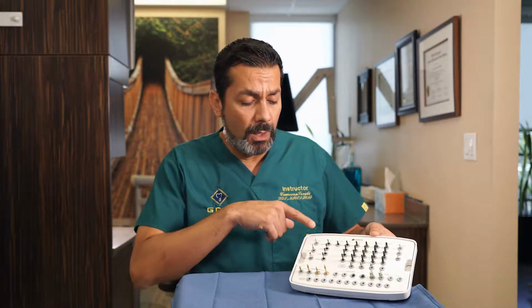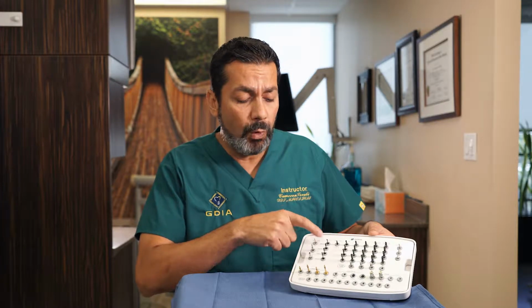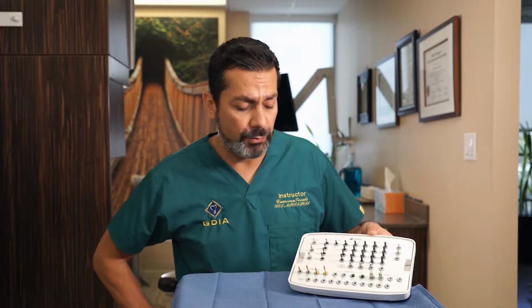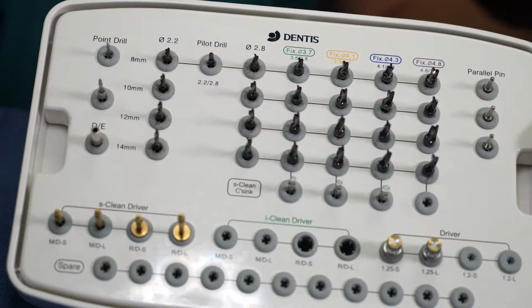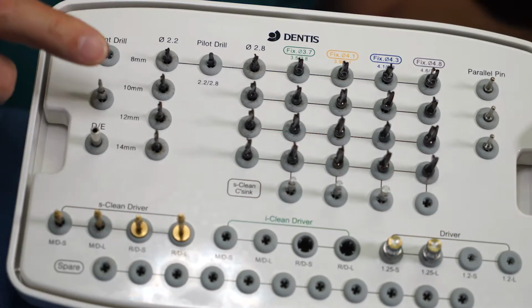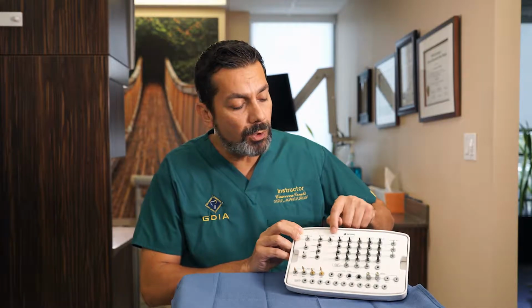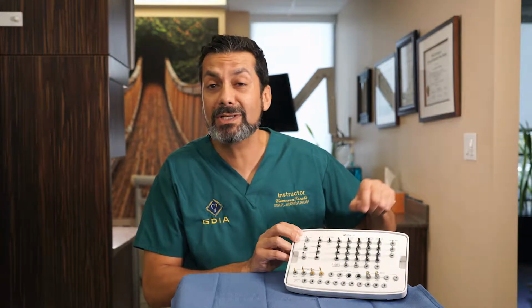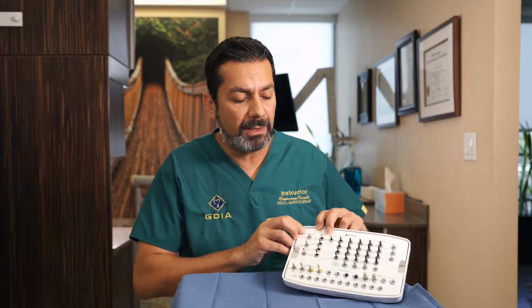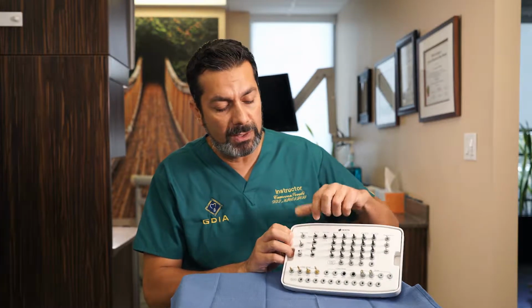drills. So the Dentis implant system comes with 4 lengths as far as your twist drills. So you start with a 2.2 diameter, and you have 8 millimeters, 10 millimeters, 12, and 14 millimeter twist drills. As you go across, these are increasing in your diameter sizes, so your drills are actually getting thicker. But the lengths are consistent all across. So the 2.2 comes in those 4 lengths.